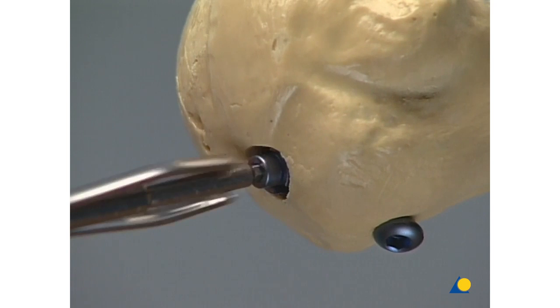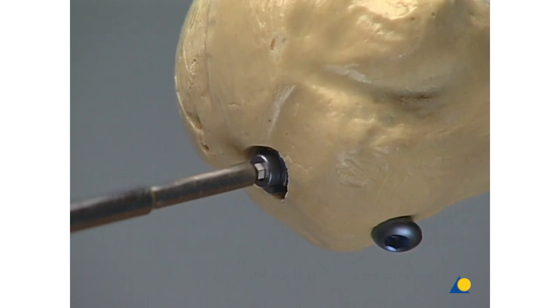Distal locking with standard freehand technique or with the radiolucent drive is not practiced in this exercise.